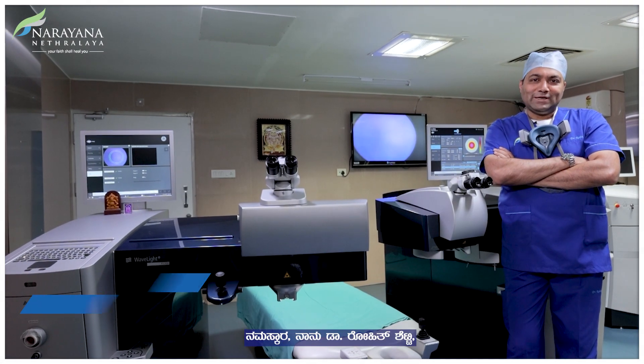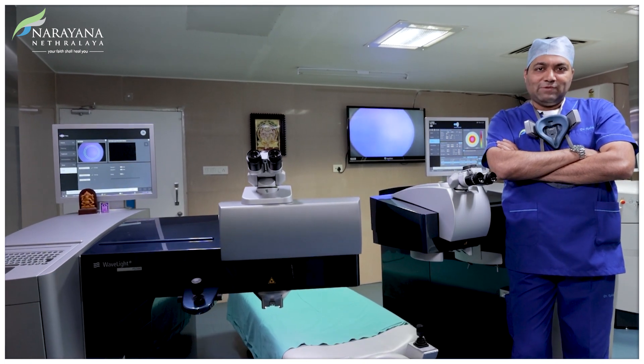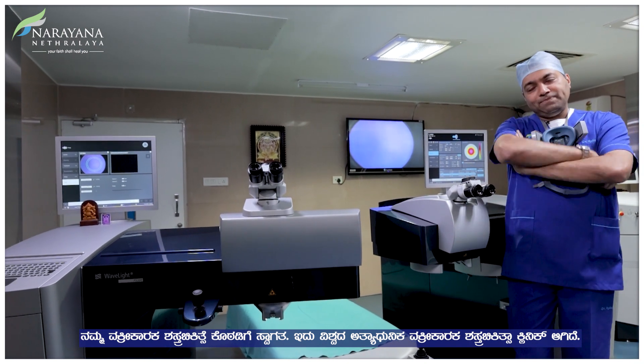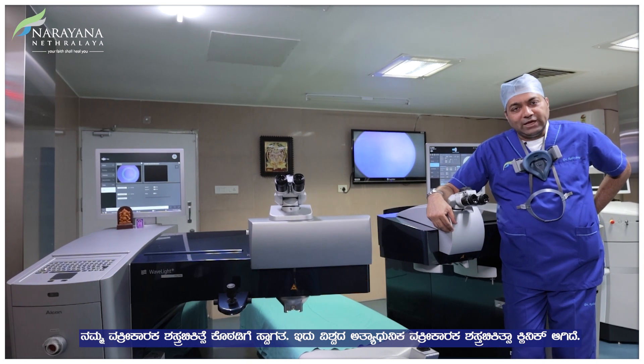Hello, I'm Dr. Rohit Shetty. I represent the Refractive Surgery Clinic at Narayan Netralaya. I welcome you all to our Refractive Surgery OR, one of the most advanced refractive surgery clinics in the world today.